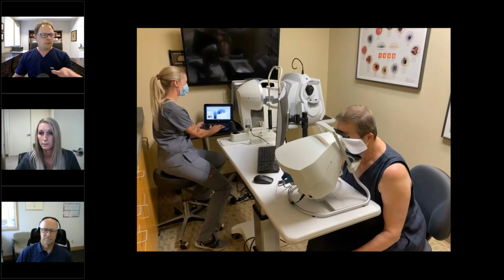Now we have to kind of move things around a little bit like Tetris in this room to do the various tests. But as you can see, she's got a laptop over there, just kind of casually relaxed. She probably has a Mai Tai hidden somewhere over in the corner or something. She's at least 6 feet away from the patients at that point. And so we just felt like that gave the staff some added comfort that they were safe when doing these tests. Yeah, so that's been a bonus for us as well. Yeah, that looks great.